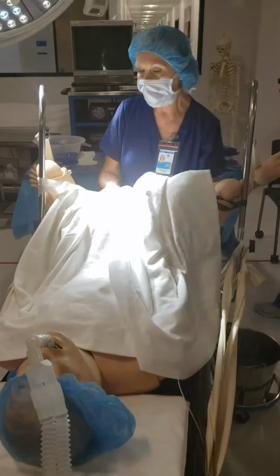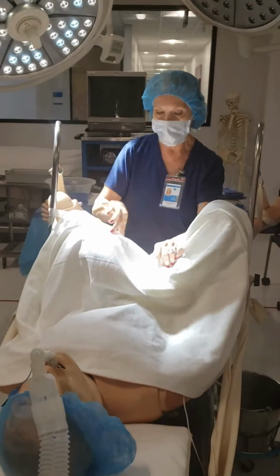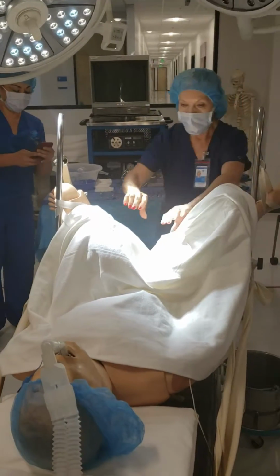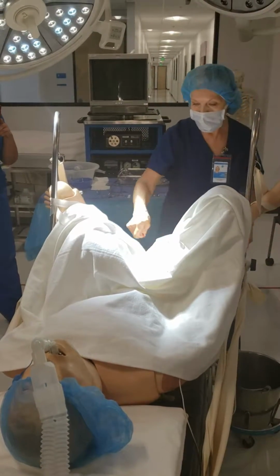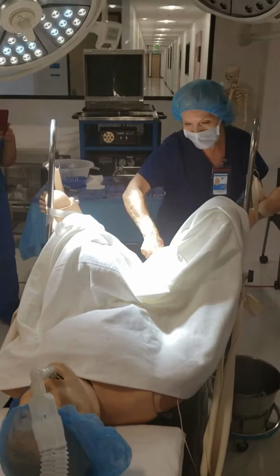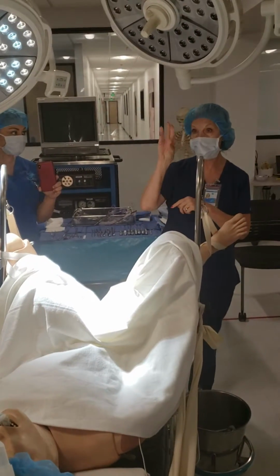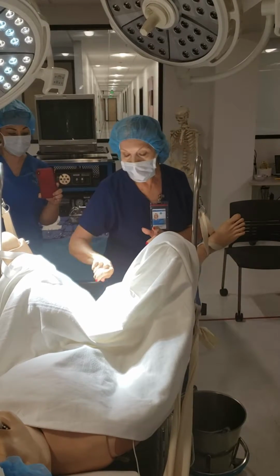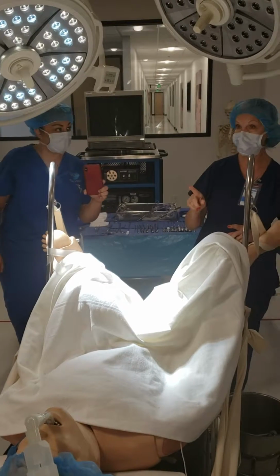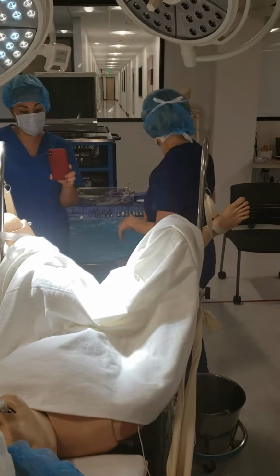All right, so now the circulator is going to be prepping the patient. So the prep goes around, toss it, another paintbrush around, toss it, another paintbrush around. The last one, they call them popsicles, they're like long sticks with a sponge on it, goes inside the vagina, and they scrub, scrub, scrub, and leave it in there. The doctor wants to see that sticking out to know for a fact that it has been scrubbed.